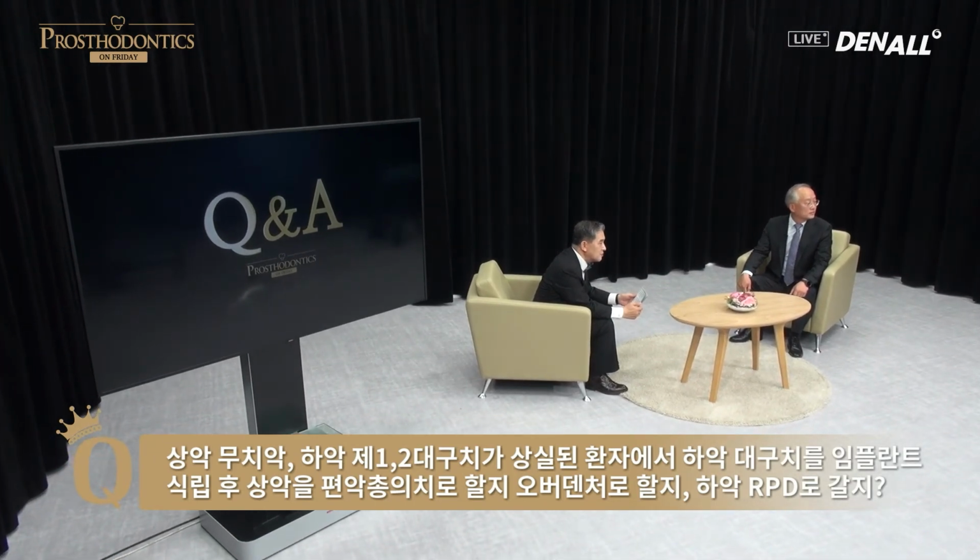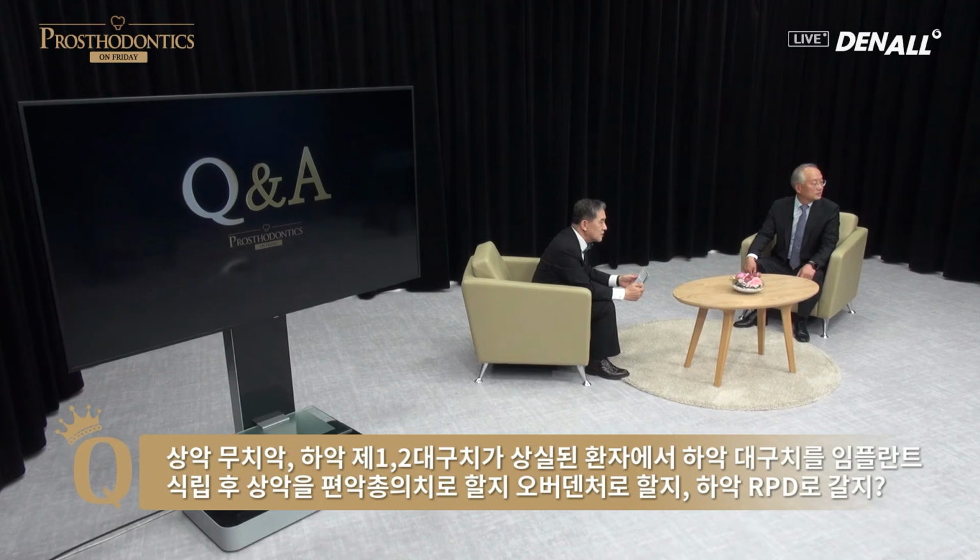I would like to ask about treatment option for a patient with edentulous ridge in the upper and on both sides, no first and second molar in the lower, whether to do implant on the lower molar and do maxillary full denture, or to do overdenture, or whether to go with lower RPD. Can I see the front part? So the maxilla, it's edentulous, and for mandible, the teeth only exist up to premolar. What kind of treatment options could be applied for this patient?